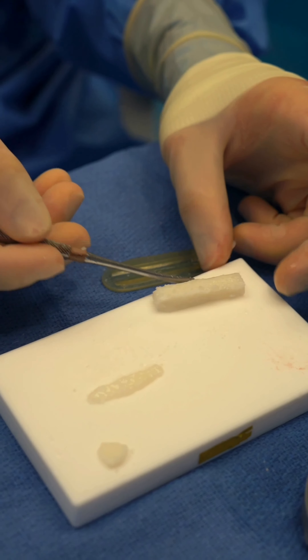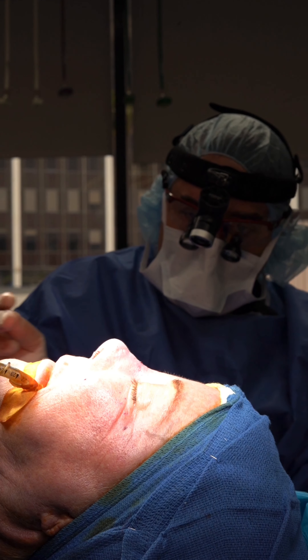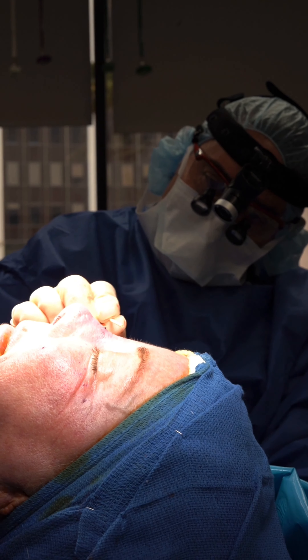This is it. We've just finished the augmentation. We have cartilage here, here, there, and there. We're going to put just a little bit more nanofat in the columella area.